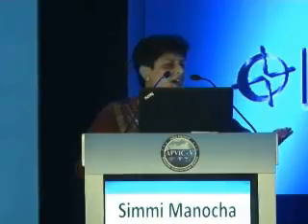Then there is a button of tissue harmonics. What is harmonics? We should know that when echoes are reflected off an object, they will return at a fundamental frequency. But in harmonics, it becomes multiples of the fundamental frequency, that it could be two times or 4 times. Higher frequency waves experience less attenuation, less scatter, and generate clearer images.